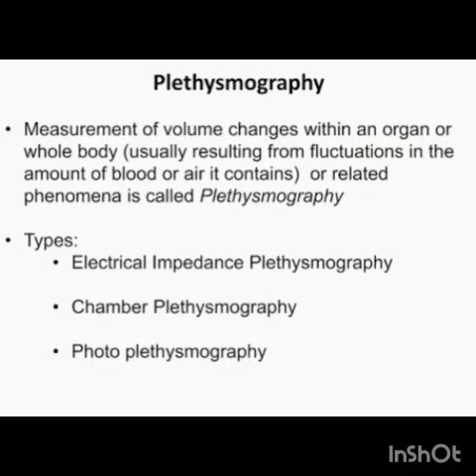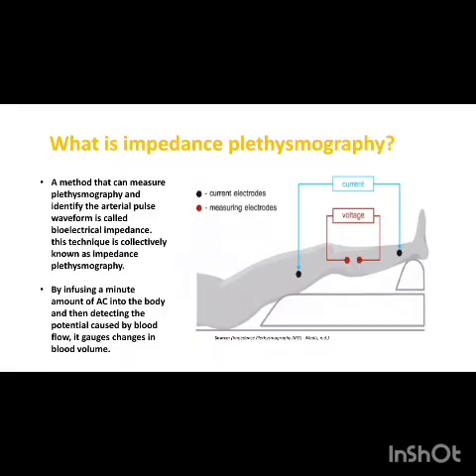Here we are using the limbs. The limb device is attached to the arms, legs or extremities and is used to determine the circulatory capacity. In water plethysmography, the extremity or arm is enclosed. The water fills the chamber and the volume changes can be detected. Air plethysmography uses a similar principle with an air-filled cuff, which is more convenient and accurate.